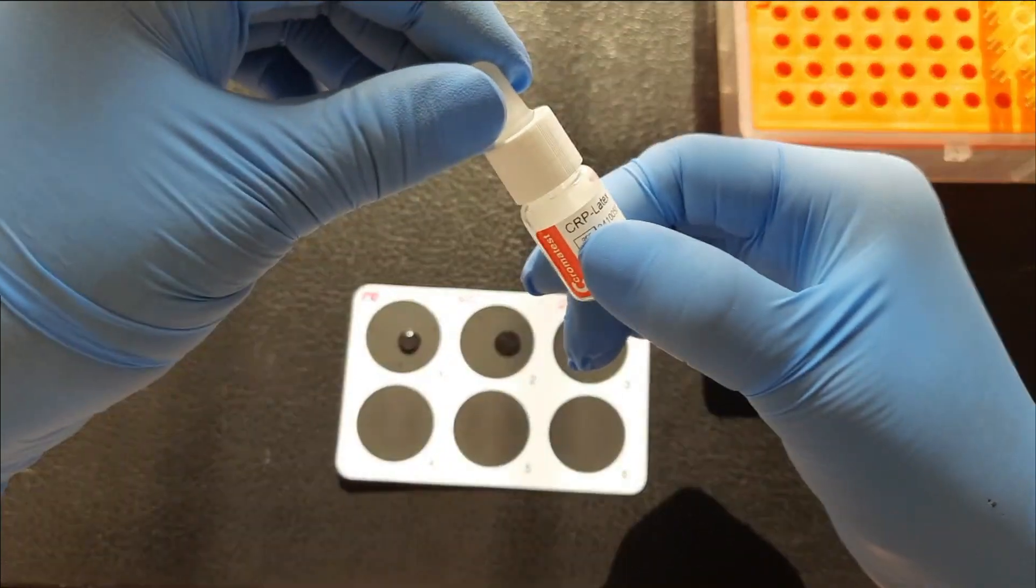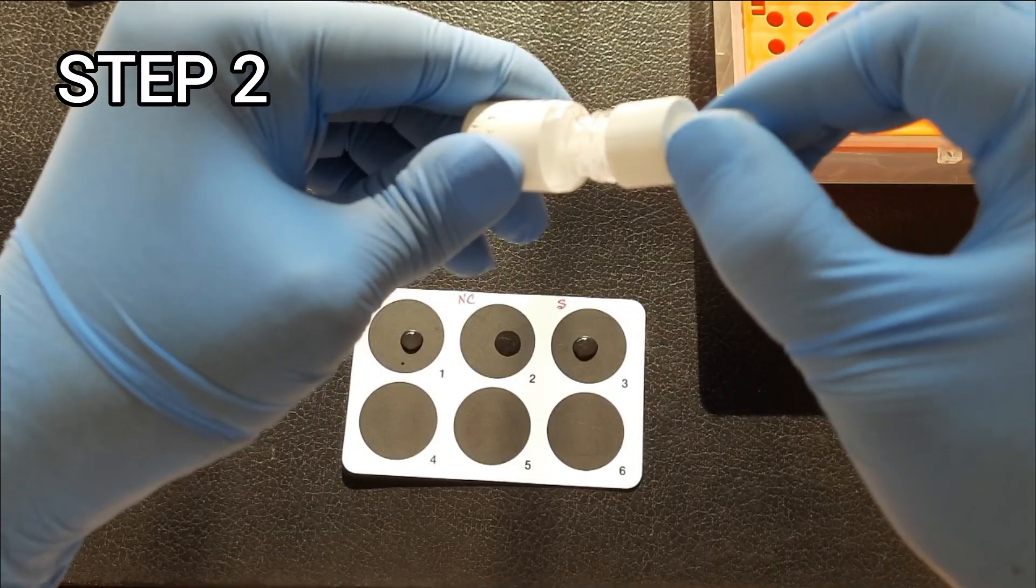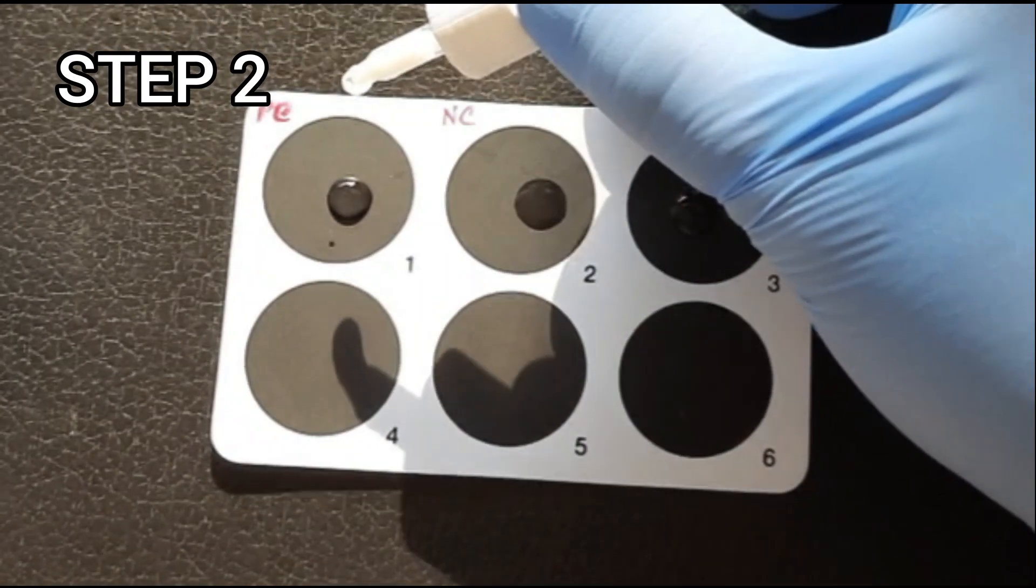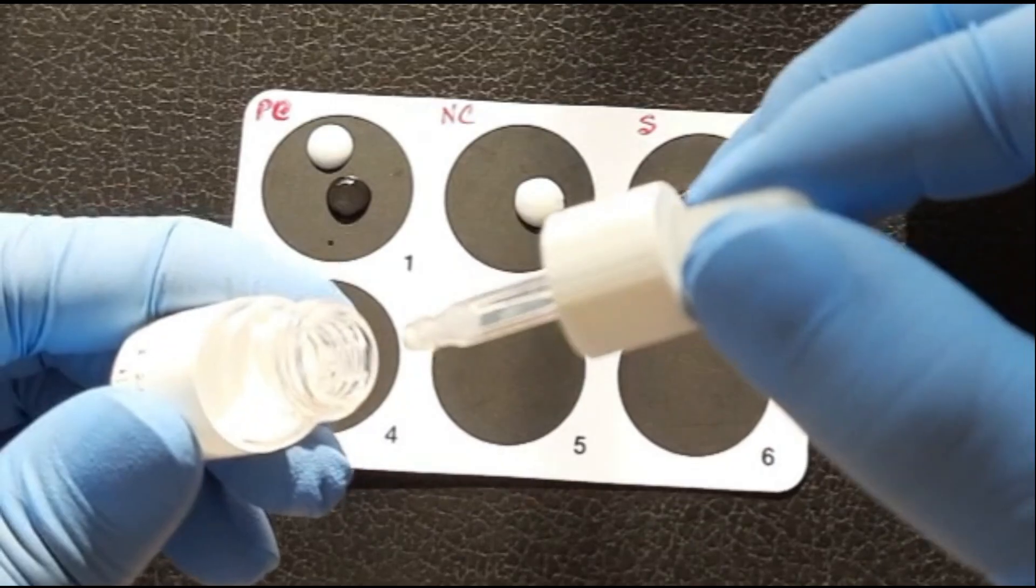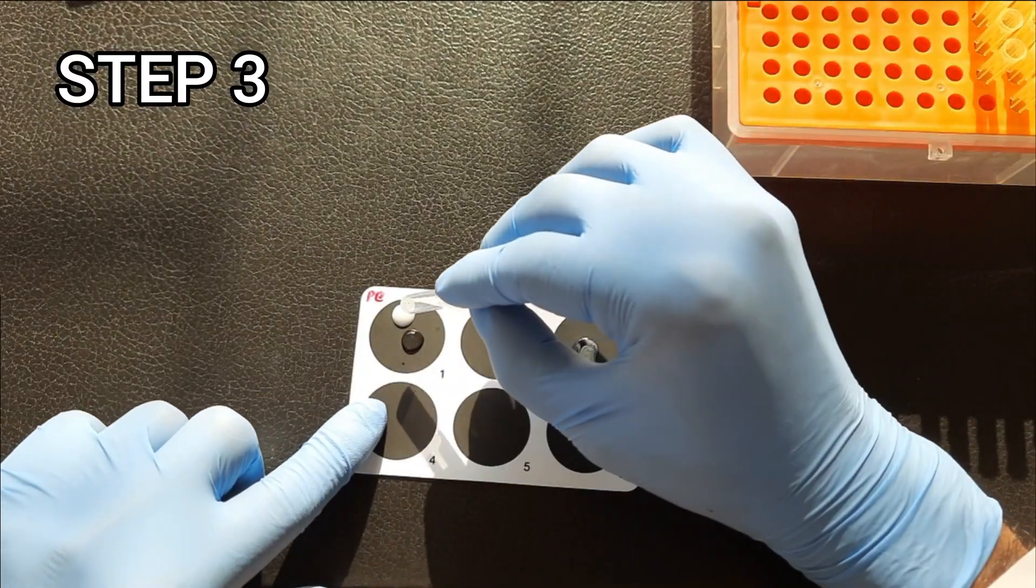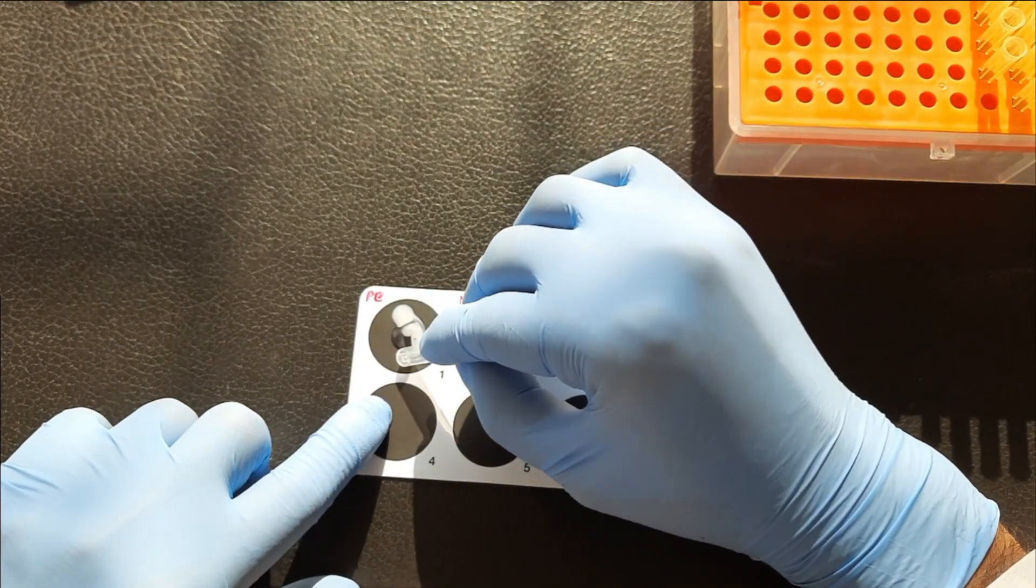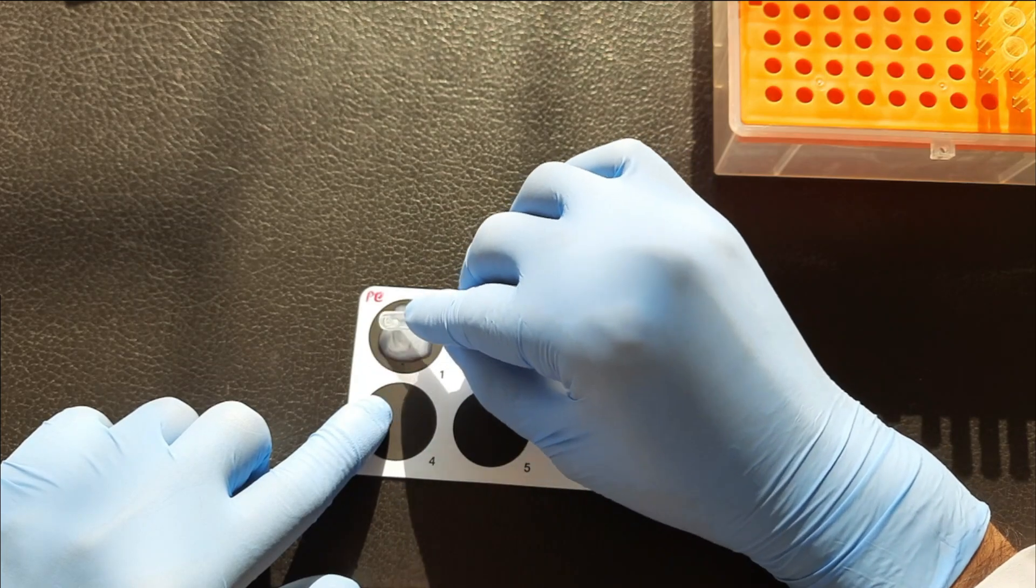Step 2. Add one drop of CRP latex reagent on each circle. Do not let the dropper tip touch the liquid on the slide. Step 3. Using a mixing stick, mix the serum and CRP reagent uniformly over the entire circle.